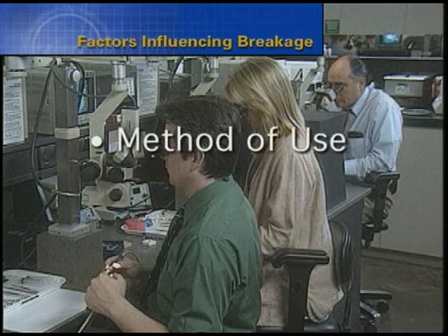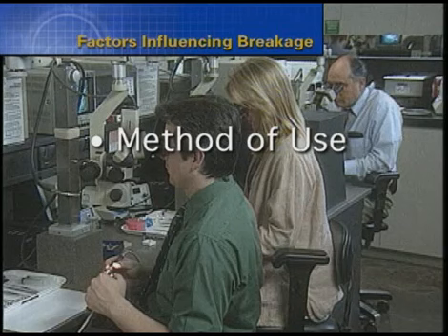Number one, method of use. Manufacturers publish specific guidelines for instrument use. Deviations from protocol increase the potential for instrument breakage. Clinicians should never use rotary instruments in regions of the canal that haven't been first secured with small hand files.